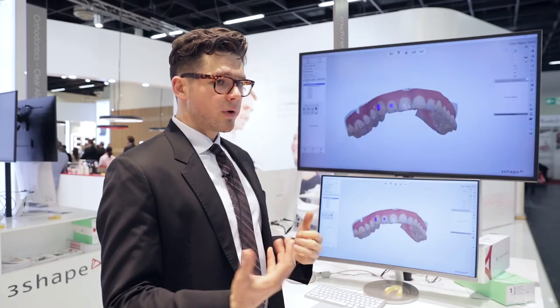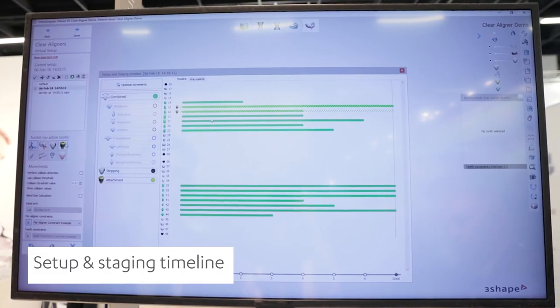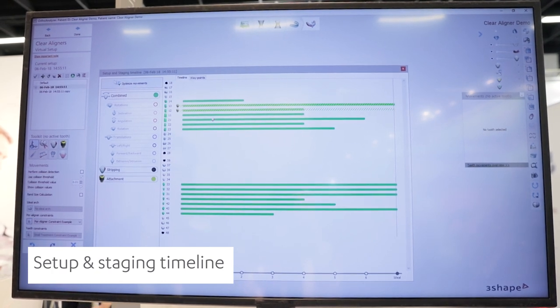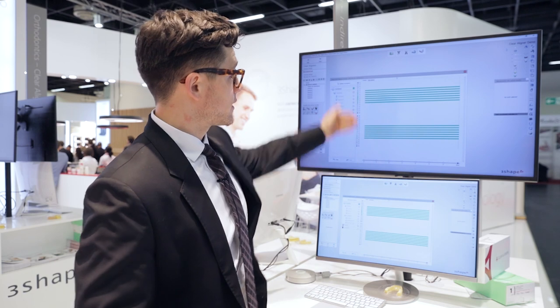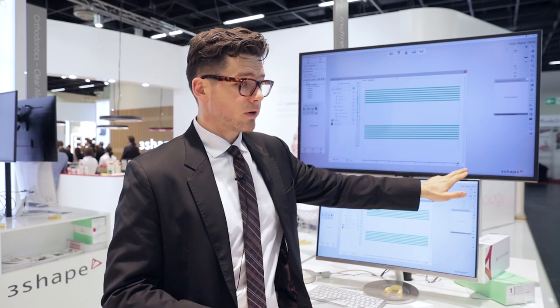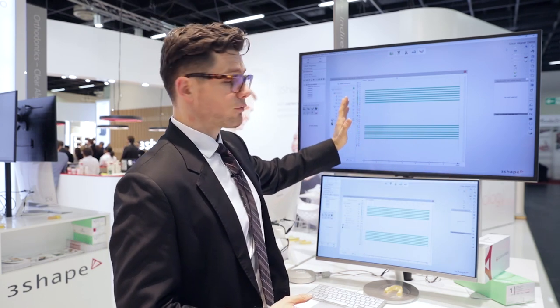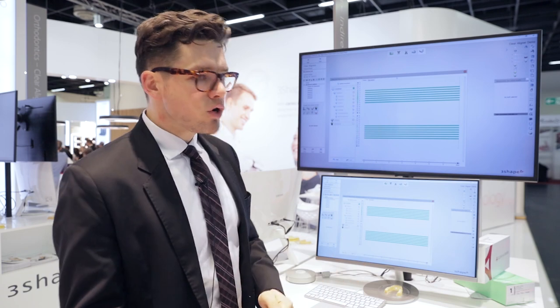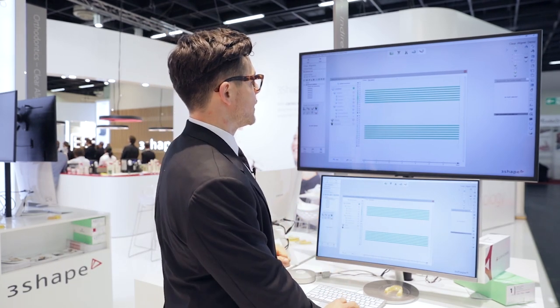The next step I'd like to show you is our new setup and staging timeline. Basically what this does — it's a super powerful tool to visualize how the treatment will progress. We have all the teeth and our stages here. For this initial setup, it splits all the movements into equal increments. But if I wanted to delay a movement or do something earlier or later, I can do that very easily now.